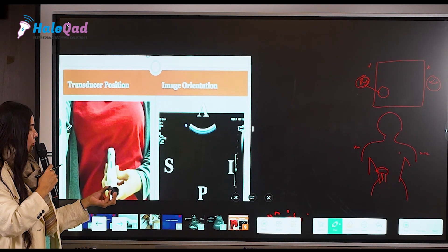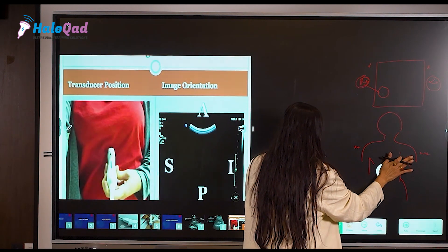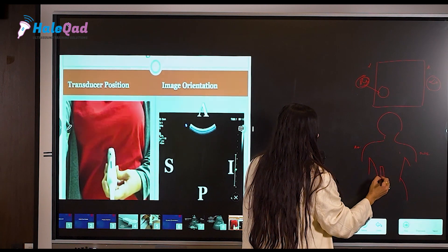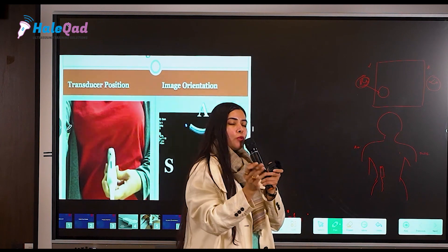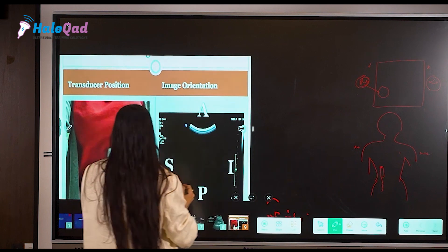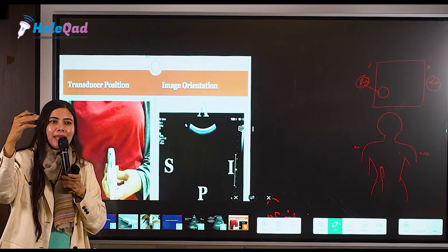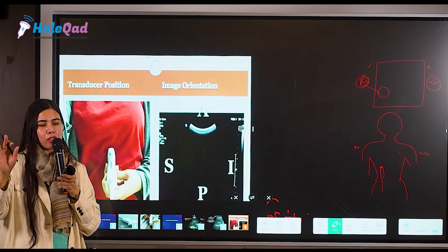Now what happens if my probe is in a vertical manner? The probe was horizontal; now I have put it vertical. I'm holding it like this and my marker is here. I now have to keep my marker in the upward position — towards the head of the patient, the cranial end. You can put your marker anywhere and hold your probe in any fashion you want.